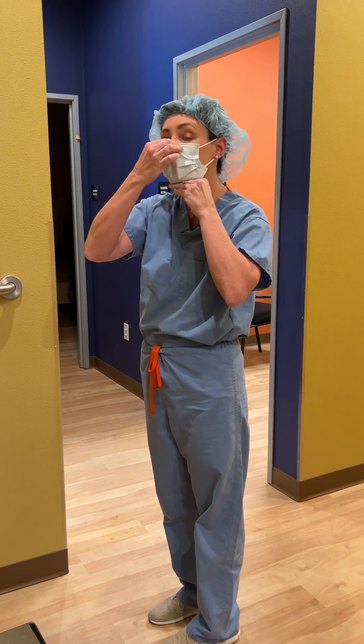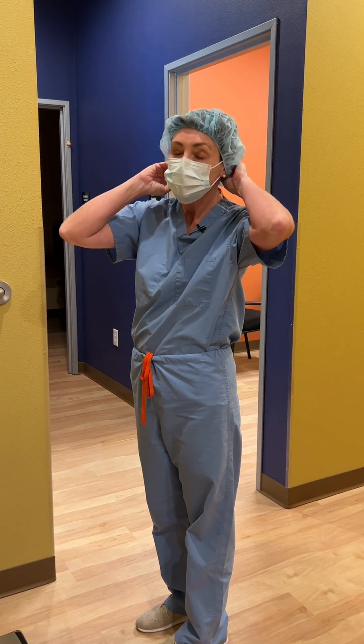We basically set up a surgical suite for this procedure.